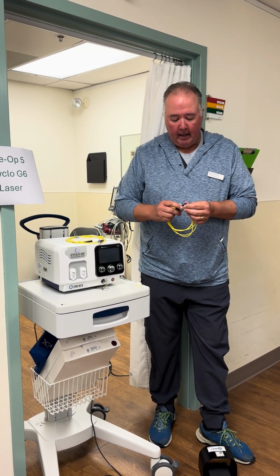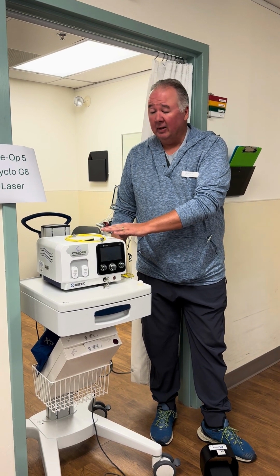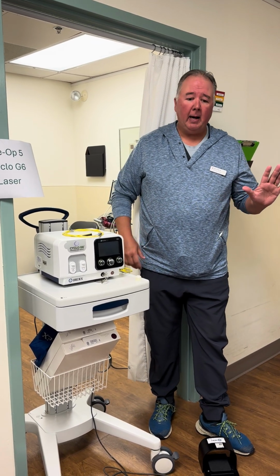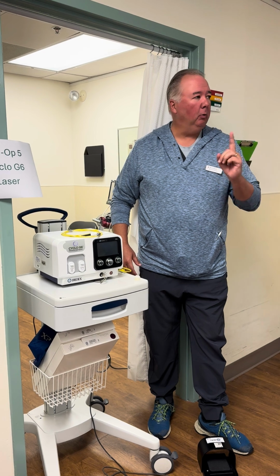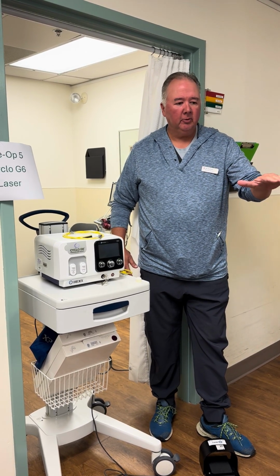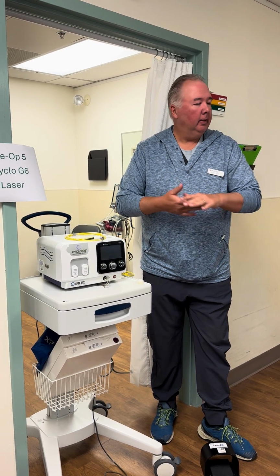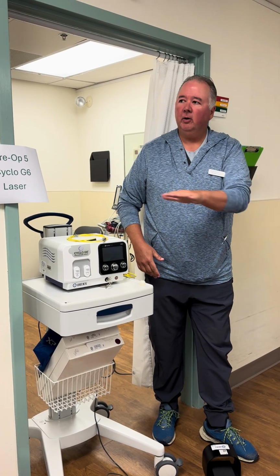Essentially what the micropulse is doing, the less invasive one, if you think about if you had a candle with the flame on it and you go really, really slow and hover over the flame, it'll burn your hand. If you go fast, you're not going to feel anything.